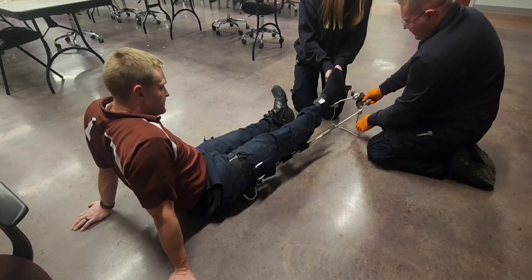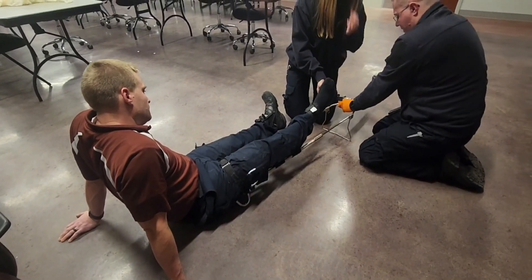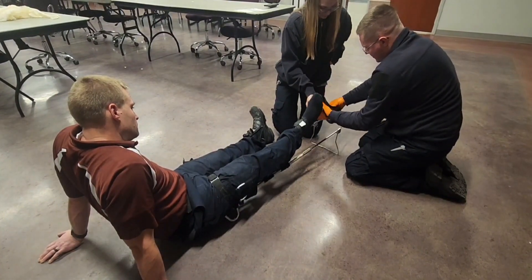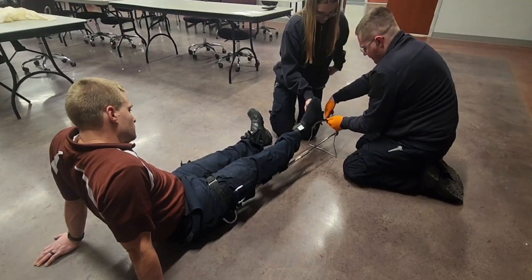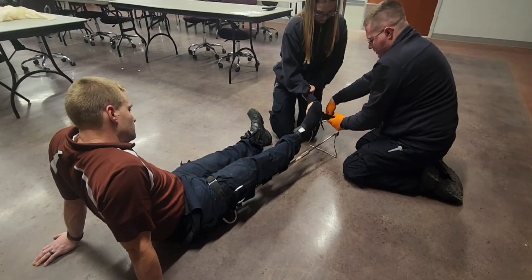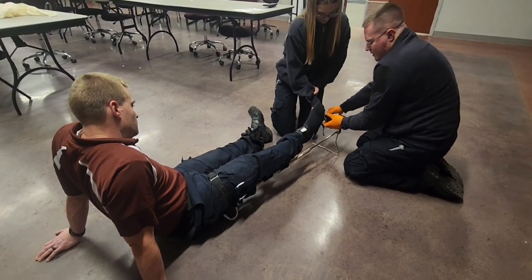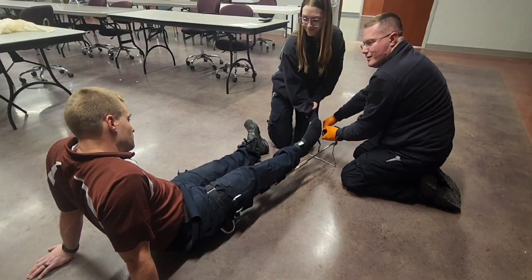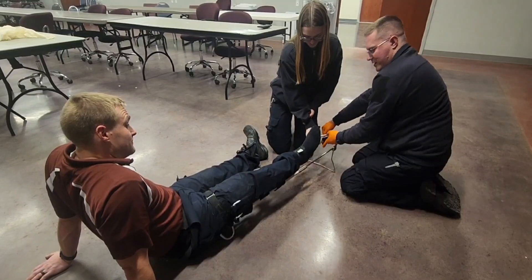I'm going to prop the splint up, pull out the mechanical traction, hook it up, and keep it on while I do this. Now I'm going to pull this tight until the patient feels relief. Let me know when you feel some relief. I feel relief.